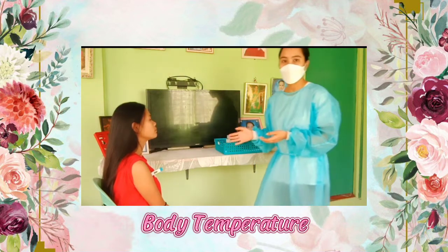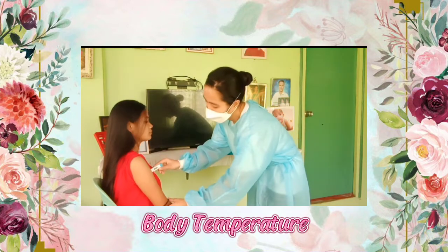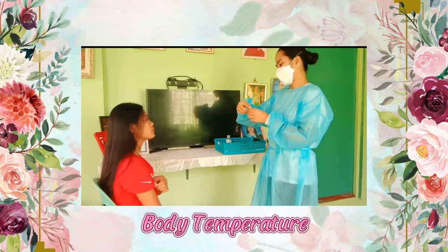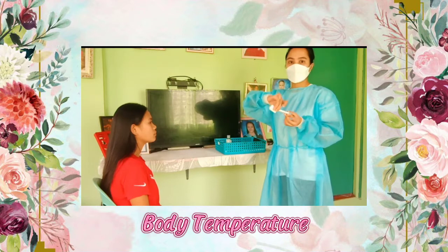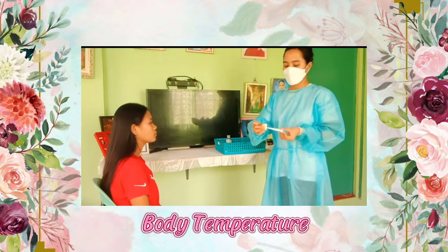The thermometer already sounded, which indicates that we already obtained the body temperature. Remove it and record the readings. Your body temperature, ma'am, is 36.2 degrees Celsius, which is actually normal. Disinfect the thermometer from the stem to the bulb and return it to its case.